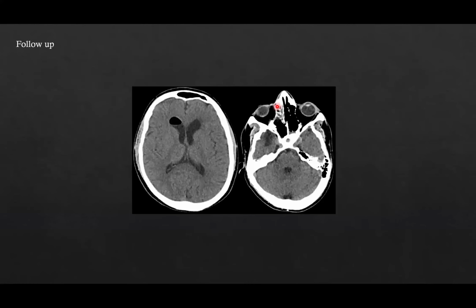Again, this is a follow-up. After the second surgery, after treating this defect in the sphenoid, his pneumoventricle and pneumocephalus resolved, his mass effect resolved, and the hypodensity seen in the temporal lobe, which would probably mean, secondary to a leak or a defect at that site, an abscess forming or encephalomalacia forming, was also showing resolution. The patient was discharged home without any neurological deficit.